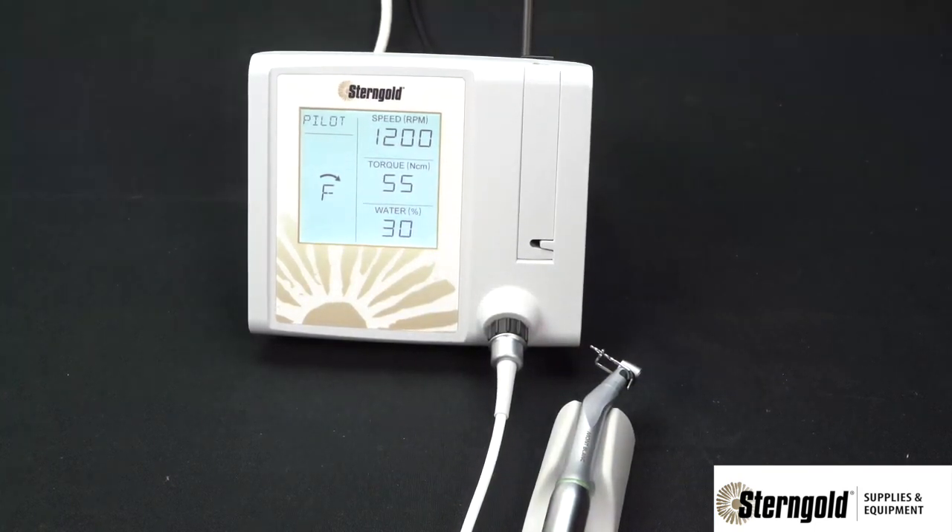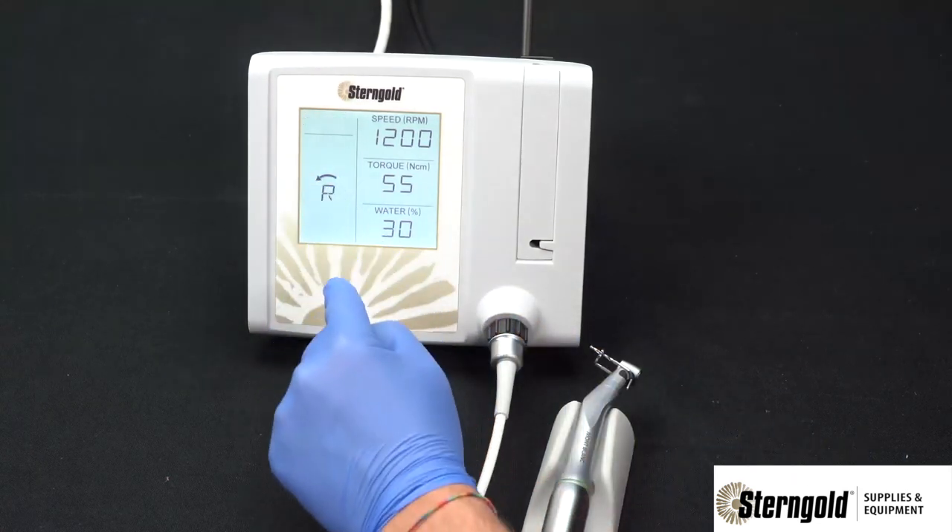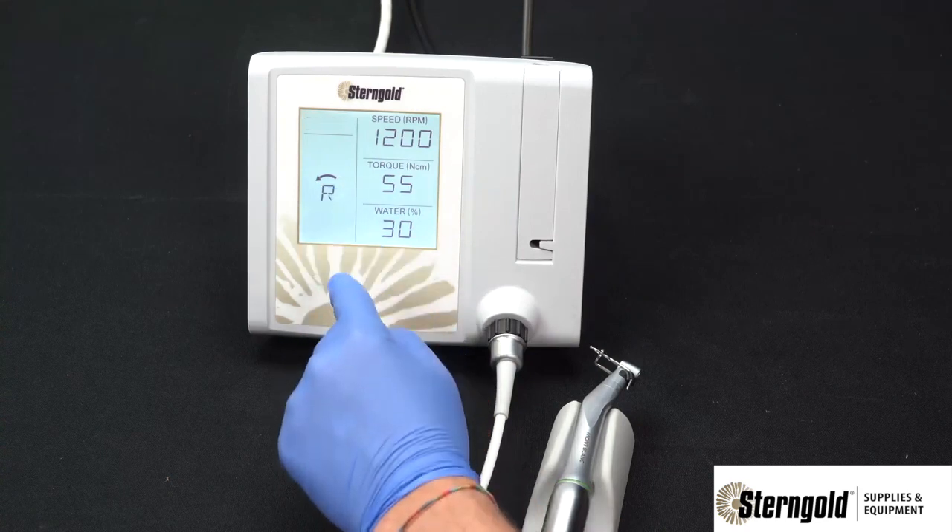To change the direction of the hand motor or micro motor, simply press the adjustment section on the operating screen to select either forward or reverse.